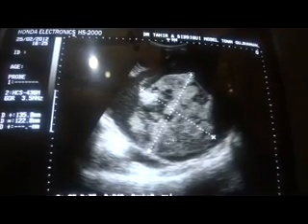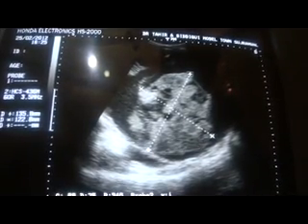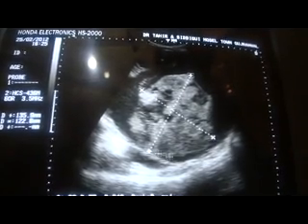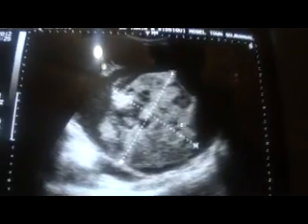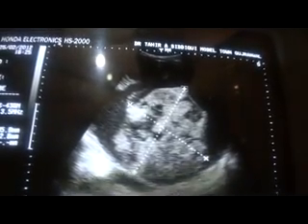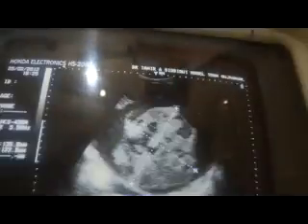This area is seen at the posterior margin of the cystic area. The cystic area is this one. So this echogenic area measures approximately 13.5 centimeters by 12 centimeters. And you can see it is anterior to the aorta throughout its length. You can see the aorta posterior to the mass.